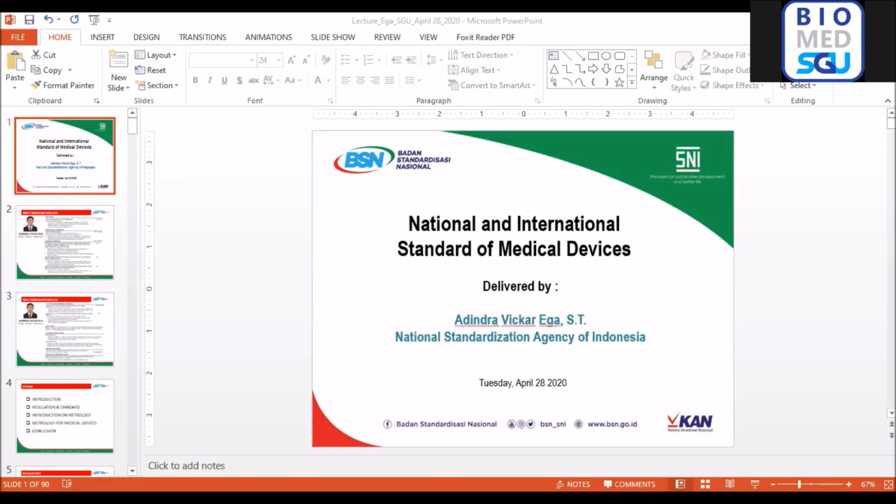It is a sub body of the Ministry of Health whose task is to test all the medical devices so that they are calibrated according to the standard. By law, accredited hospitals or clinics are required to have their equipment calibrated once every while, I think once every year, if I'm not mistaken, so that then the hospital can be accredited.